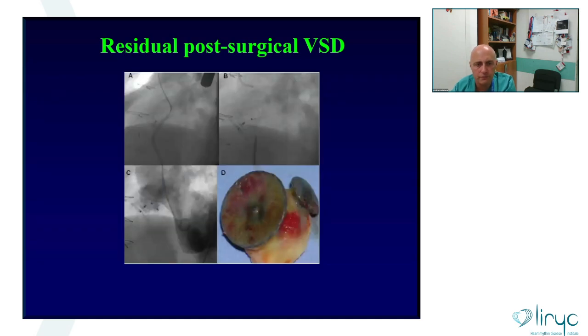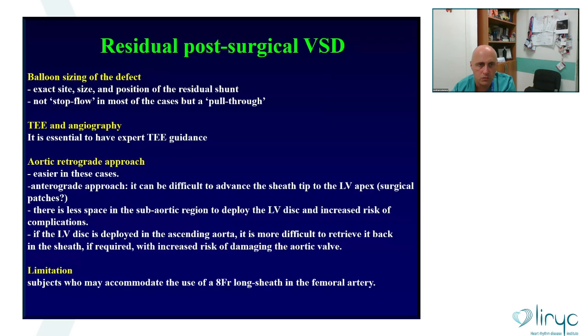Sometimes even after having put one or two devices, as in this case, you can see on the right side of the screen it was perfectly closed. This patient now developed a third residual VSD, and finally was operated on with surgery.